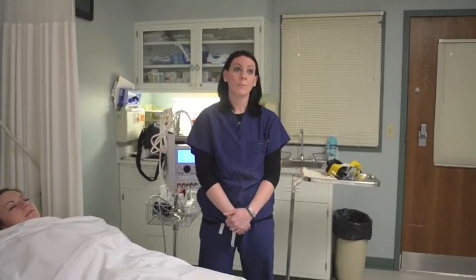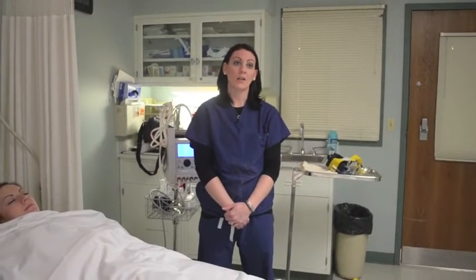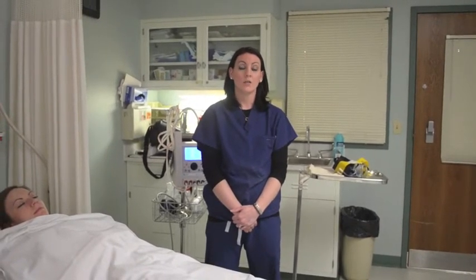First, let's discuss what a pneumatic tourniquet is. A pneumatic tourniquet applies pressure to occlude blood vessels or blood supply to a certain limb during surgery. The purpose is to maintain a bloodless field to ensure visualization for the surgeon. Three parts of the pneumatic tourniquet allow this to work properly: an inflation cuff, connective tubing, and a pressure device.